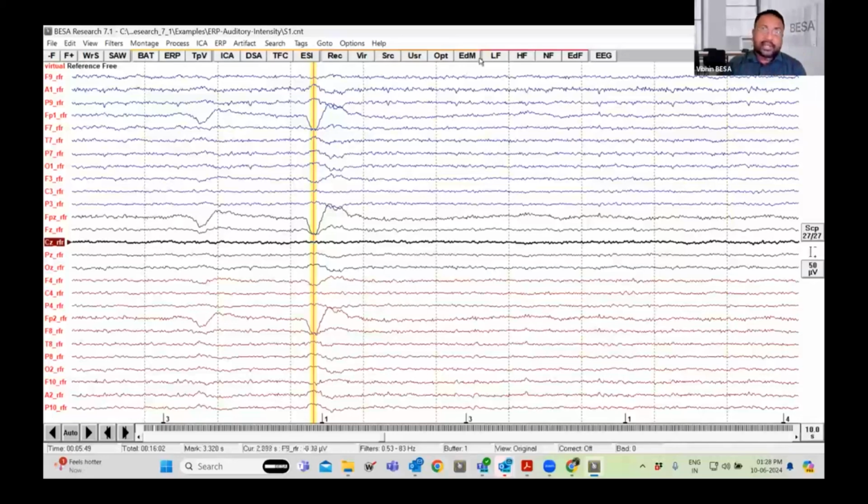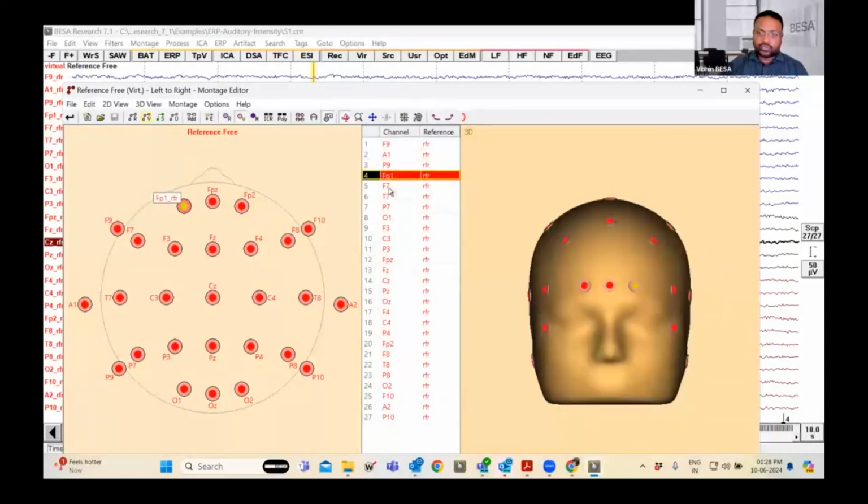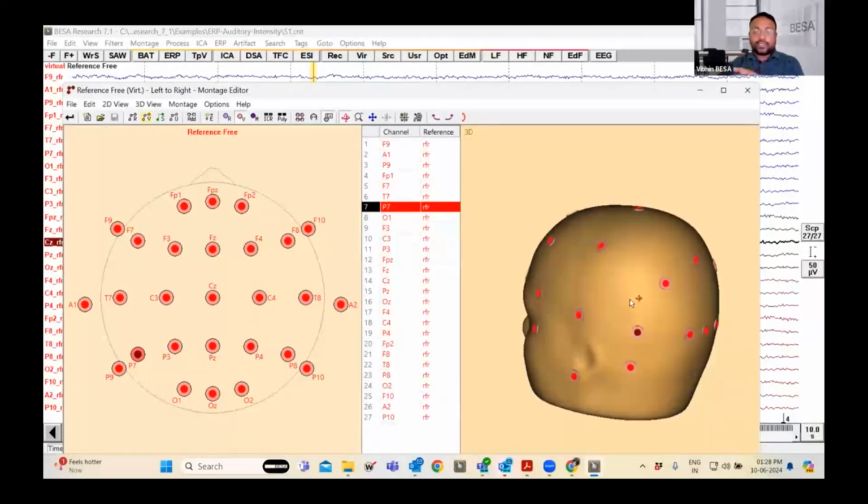Now, how do we get that? It is because when you choose this montage, let me click on EDM again. So when you click on each channel here, you can see which channel it shows. How you're able to see that activity in CZ also is because here the surface integral, all the activity over each channel has been integrated, and when you sum all the activity up, the integral should be 0. And then that is the reference to each channel. So each channel should have some activity which is slightly above the integral zero activity. Harald, please do correct me if I say something wrong here.